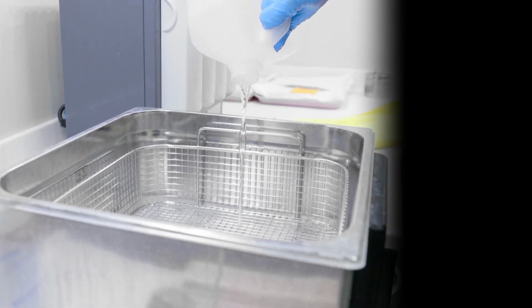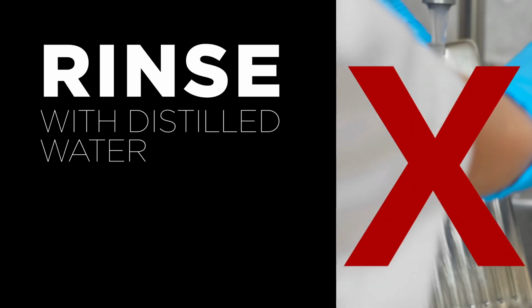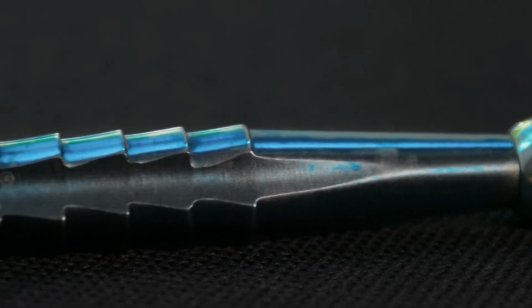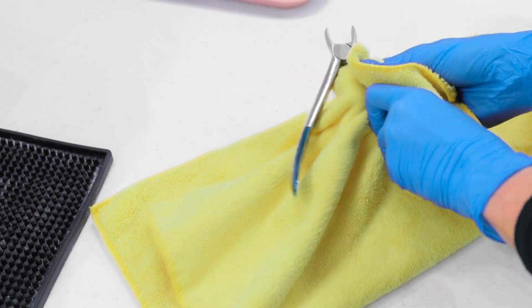Following ultrasonic cleaning, rinse instruments with distilled water. Avoid rinsing your instruments with regular tap water as it has minerals and high concentration of chloride, which can result in pitting corrosion or spots on your instruments. Once instruments are rinsed, make sure to completely dry them before moving to the next step.